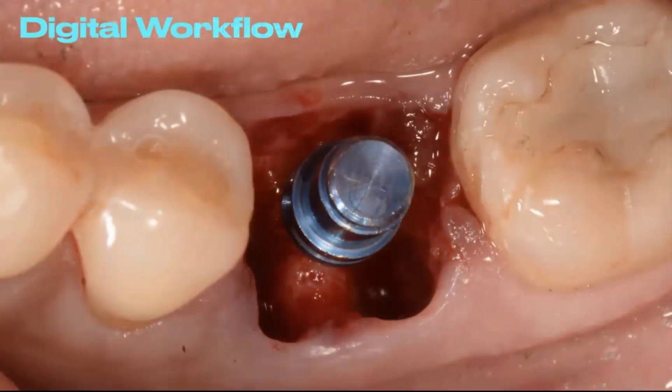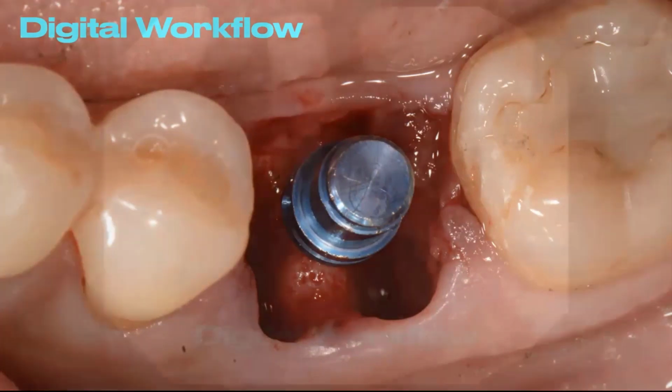And so we use our surgical principles to drill. Now, how do we do that? Well, in this particular case, we use guided surgery. Guided surgery allows us to drill based off a cone beam CT scan, and based off an iOS scan, and based off our digital or normal impression, and then of course our surgical digital workflow.